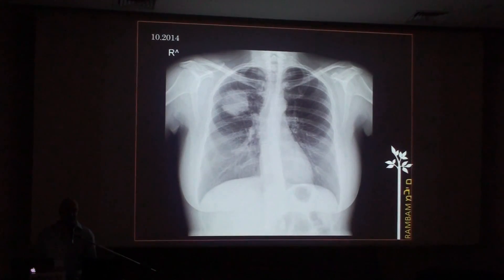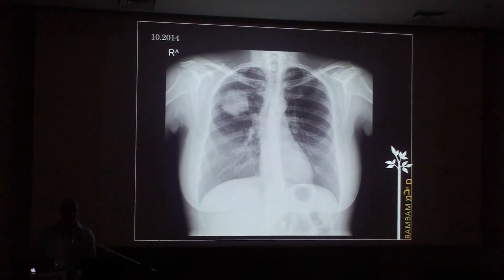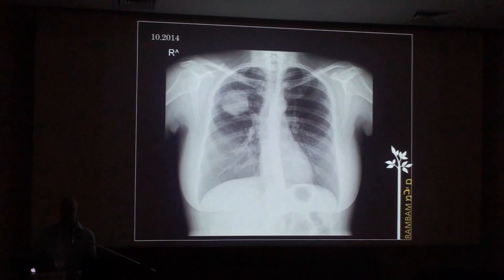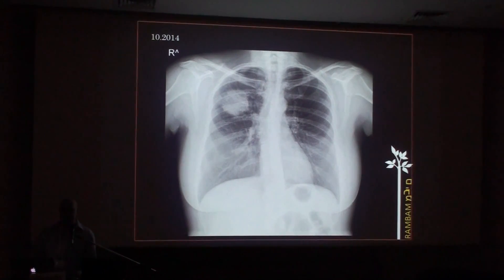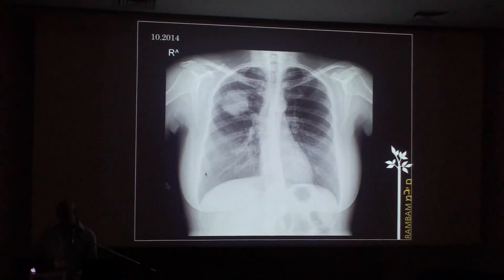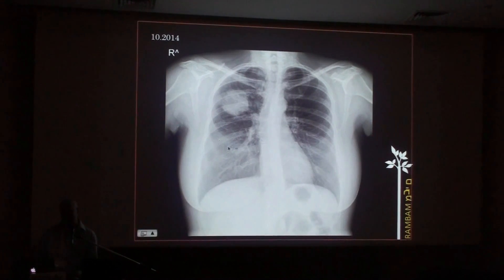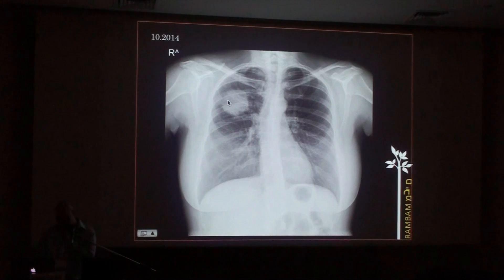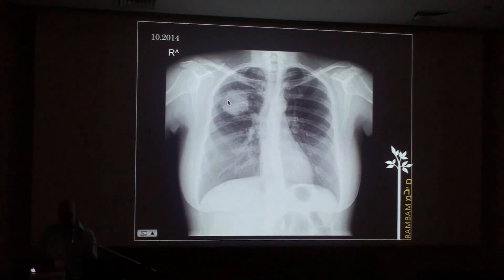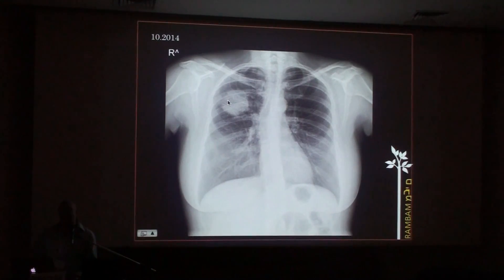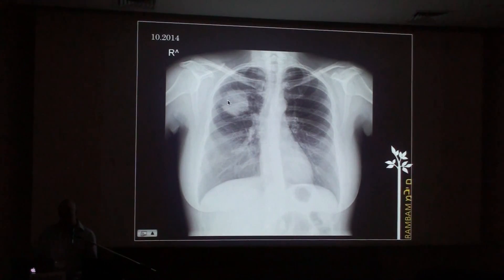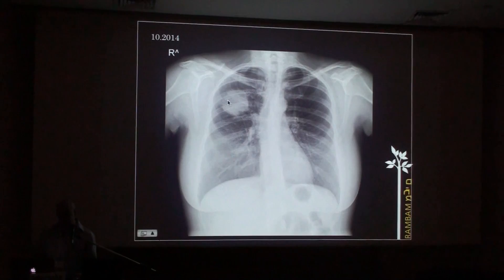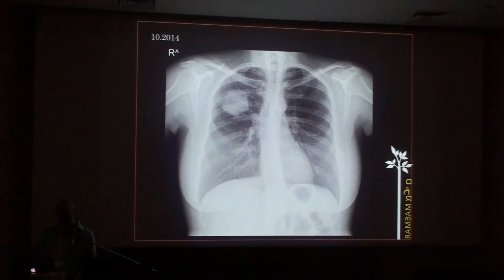Chest radiographs done in the ambulatory setting show a round opacity which is homogeneous with relatively smooth borders.